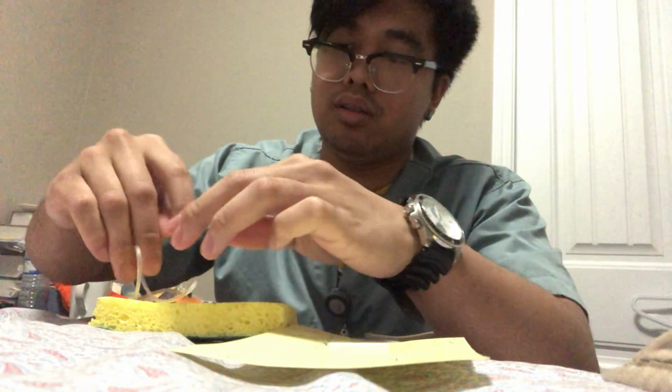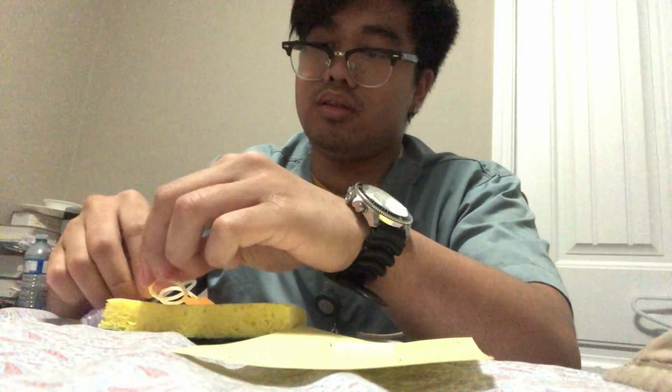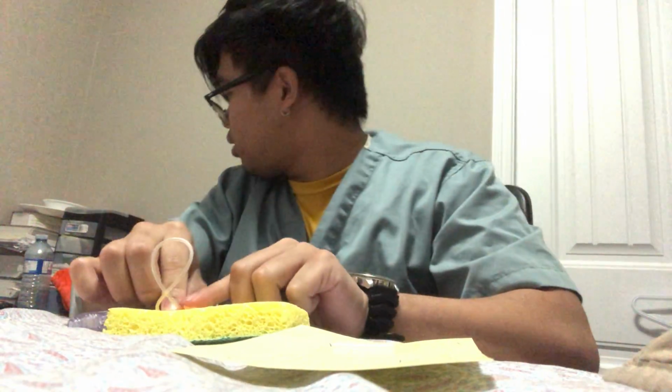And then I'm gonna coil this one, make a coil, and I'm gonna tape it. And then with the tape, I will now label it with the date that is being administered, my initial, the time, and the set concentration of it.